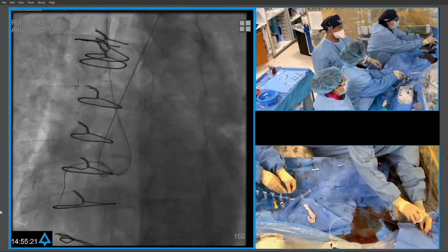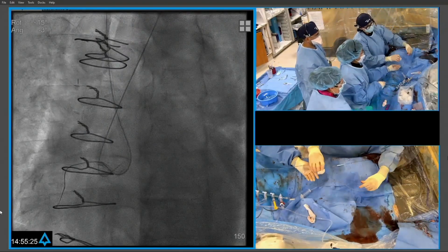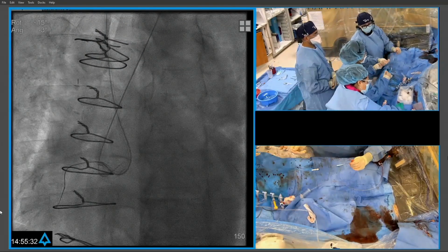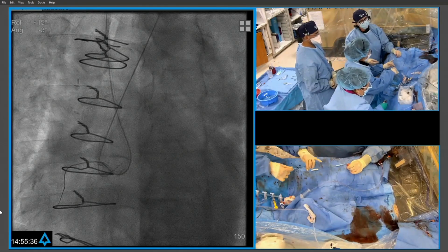And if we can wire into either the distal vessel or the marginal branch, then we're good, and we'll secure it. And if we can't do that, then I'm going to come down the septals, come retrograde and secure the vessel. So we've still got several options that we can try. So as you say, we'll probably be here for a while yet, Roxana.